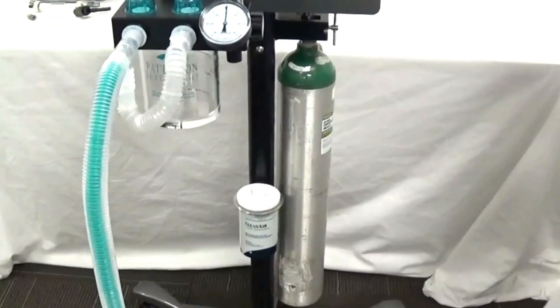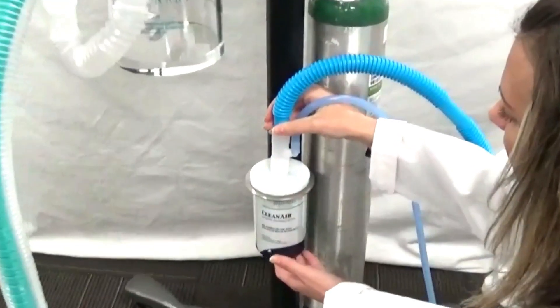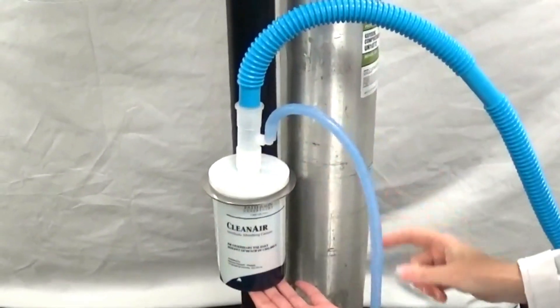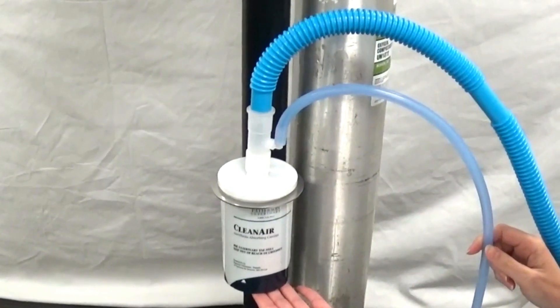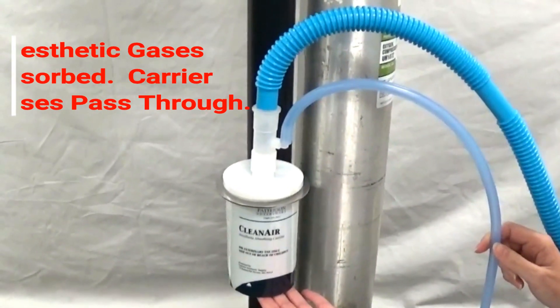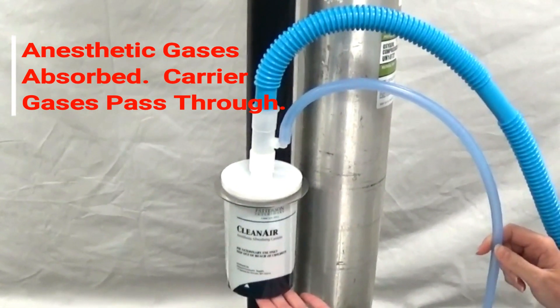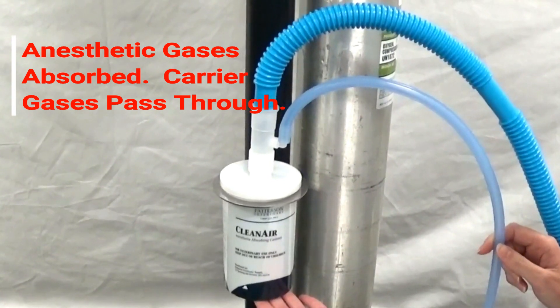First, we will attach the Riken gas scavenging kit to the clean air canister, as shown. It is important to note that the canister should either be suspended or laid on its side, so that gases that are not absorbed can flow through the bottom portion of the canister.